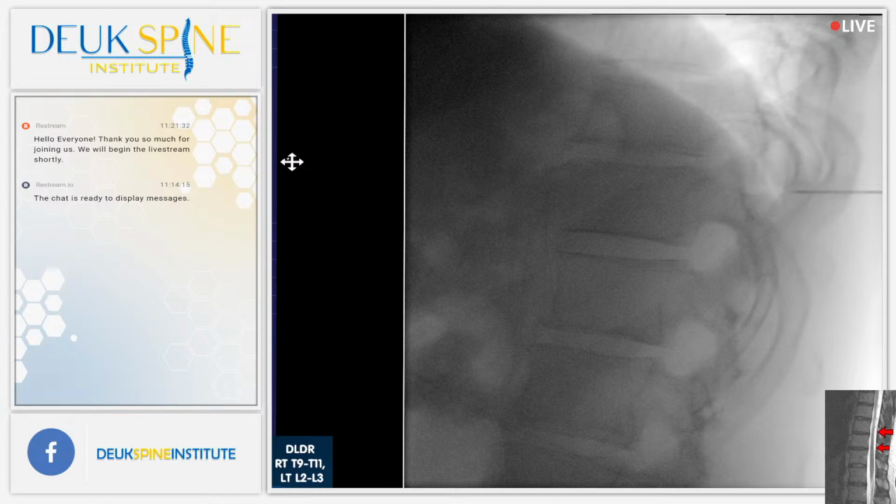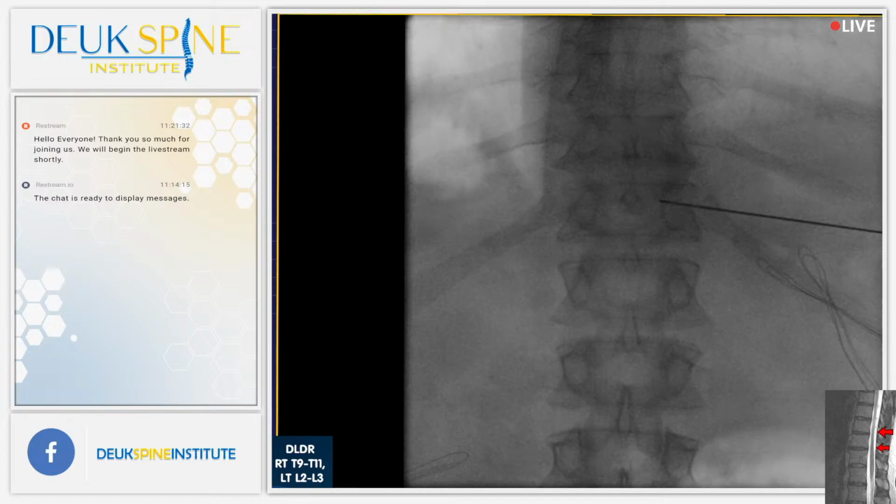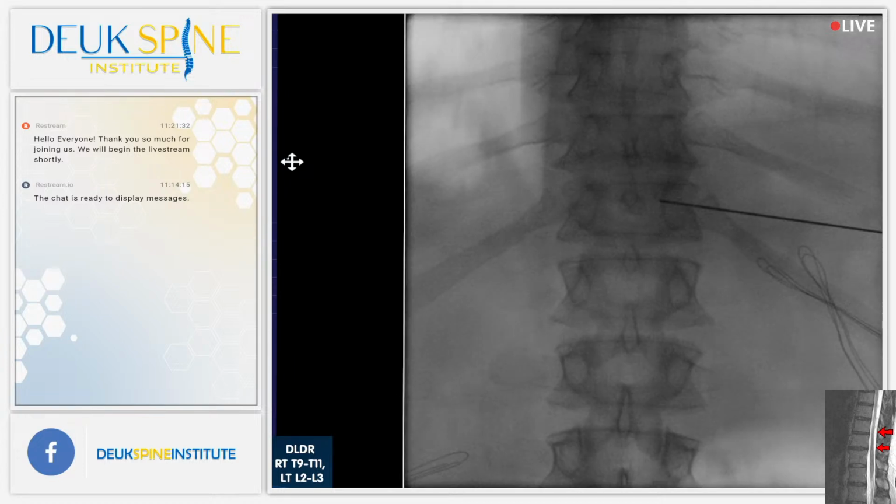Shot. I may be hitting the transverse process. We need to take a look at that. Let's go AP. So I'm going to use my X-ray machine and the bony anatomy of the spine to navigate to get to the tear in the back of the disc where the pain comes from. So I'm too medial.